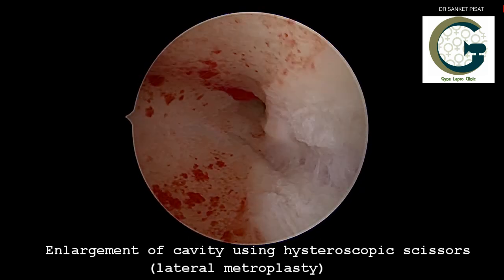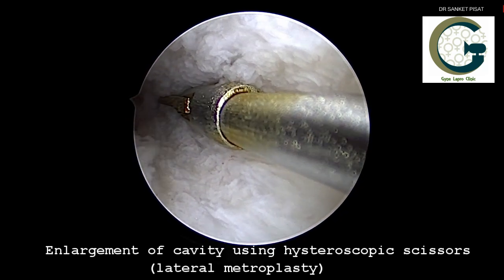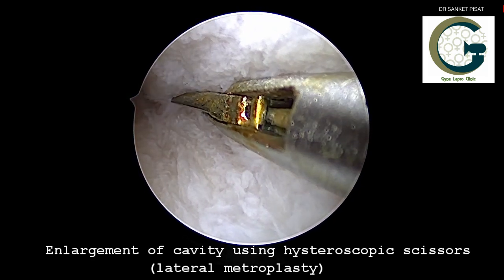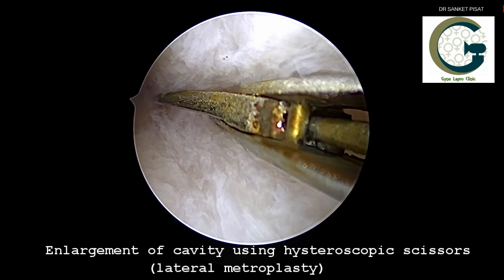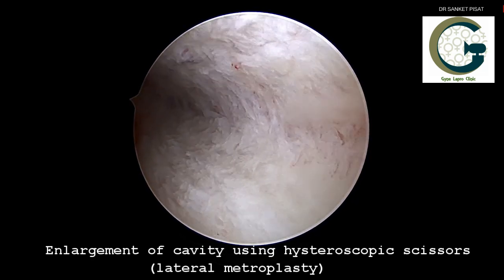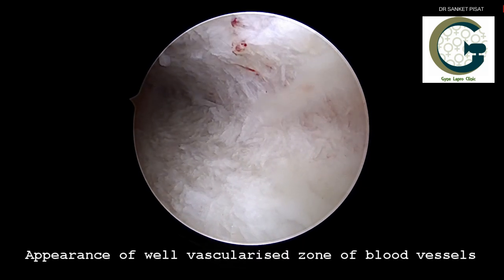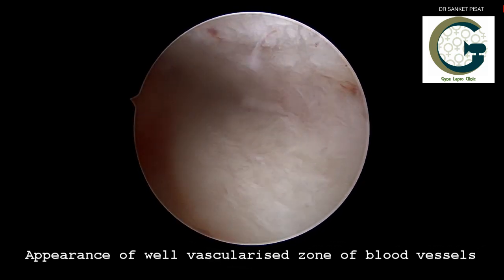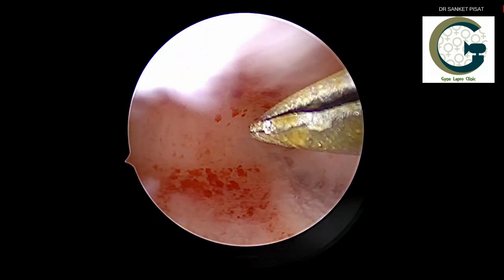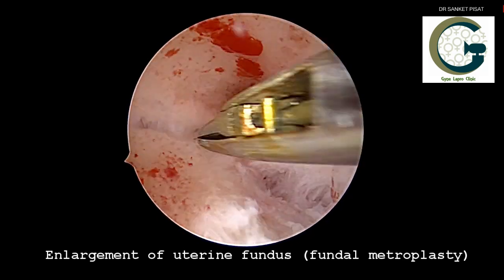As more and more cuts are made, the whitish area — the area of the uterus without sufficient blood supply — gives way to a pinkish area with visible blood vessels on the uterine surface. This indicates that the normal healthy level of the uterine tissue has been reached. Several blood vessels are now visible on this surface, confirming that healthy tissue has been reached.